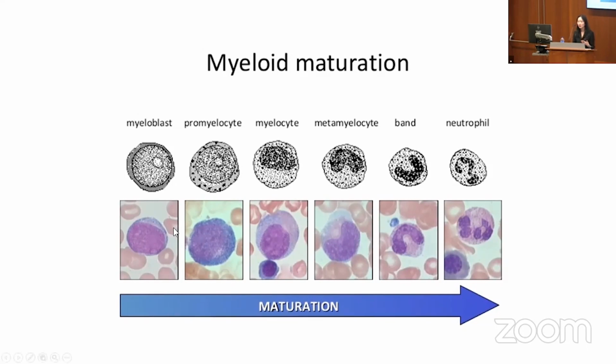We want to know what stage these cells are all at. And it's one of the beauties of hematopathology that we can see how the cells are maturing down that stage. For other cells, such as epithelial cells, skin and so on, we don't really know all these stages as well. But for hematopathology, we actually know what the normal is. And hence we can extrapolate, when things are abnormal, what stage they're coming from.